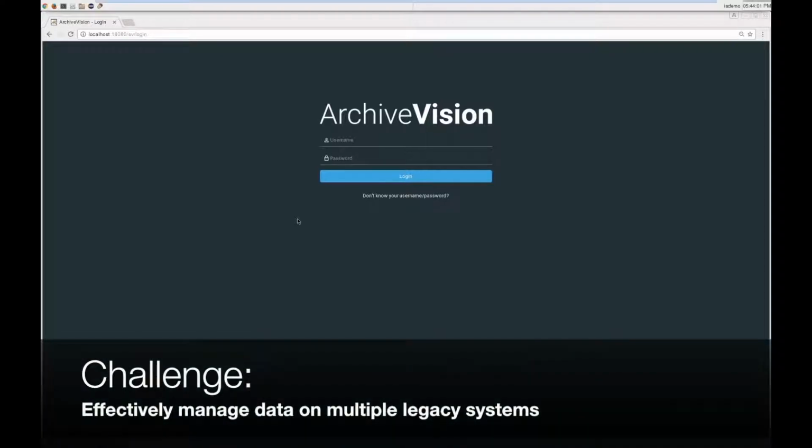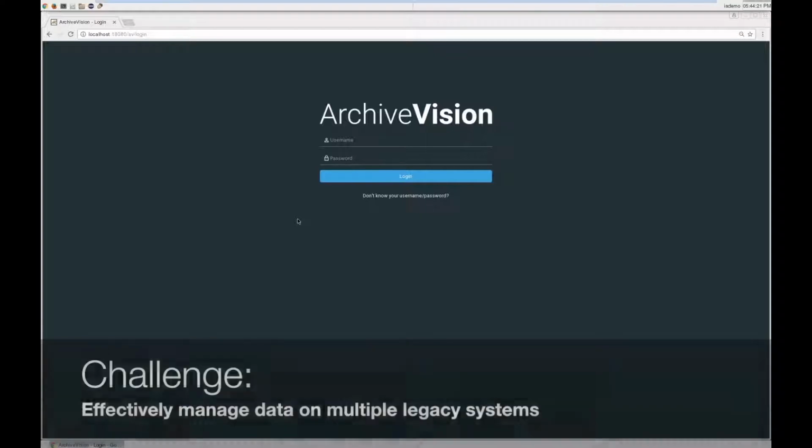As many hospitals and healthcare organizations are consolidating and their systems are being consolidated, we oftentimes find a new EMR system that has maybe the current 2 or 3 years, and yet we have lots of legacy healthcare information in legacy systems that need to be dealt with.